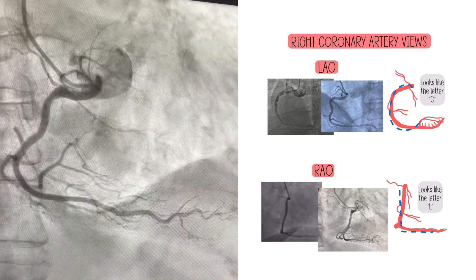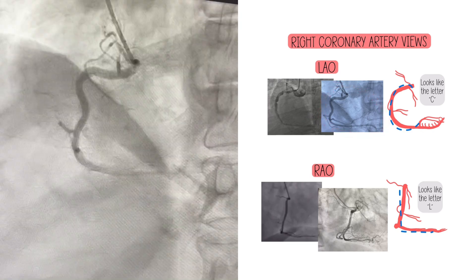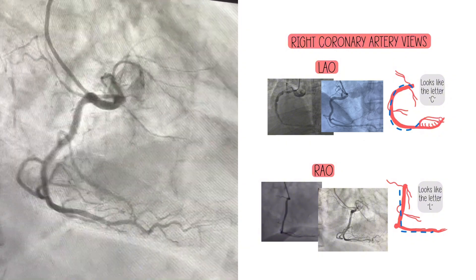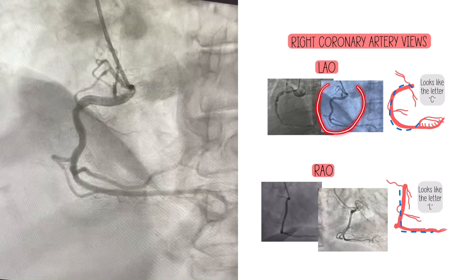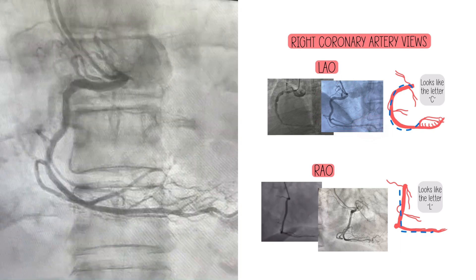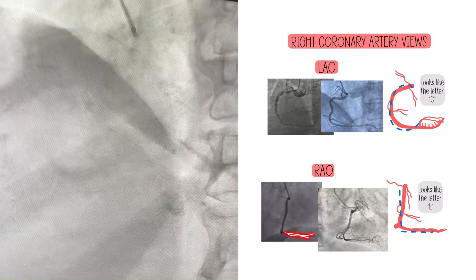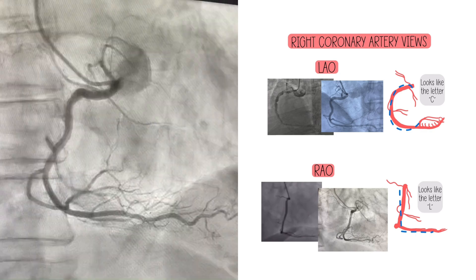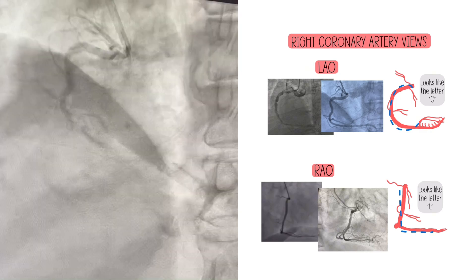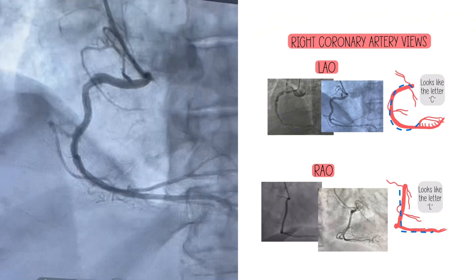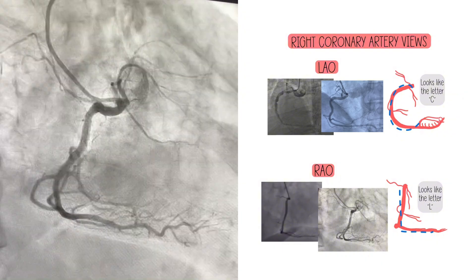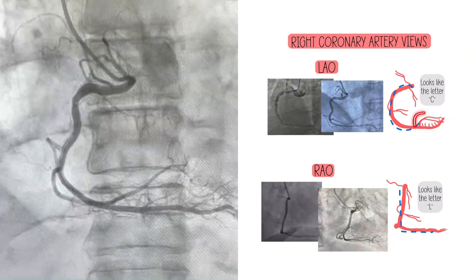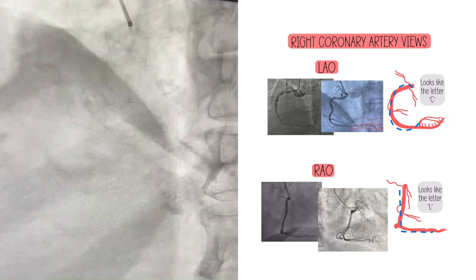Can you identify every single vessel in this picture — the conus, the SA nodal branch, RV branch, PDA, PL? In the proximal segment, maybe. But in the distal segment, you have quite a bit of overlap; several branches are overlapped and hard to distinguish. Remember what we said about the LCA — we can't always identify every single vessel in one view, and that's okay. This is where using a cranial or skewed view might come into play, to separate out that distal bifurcation.